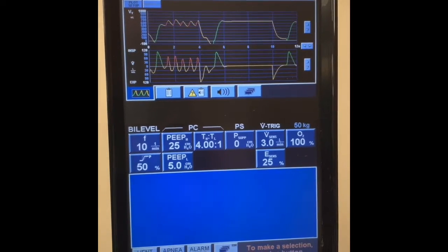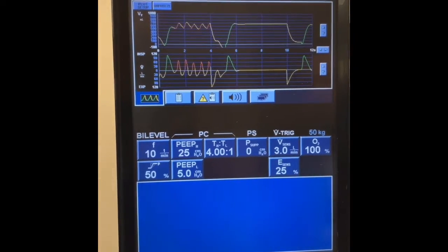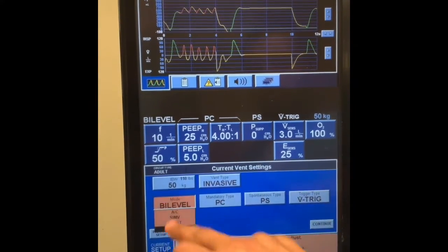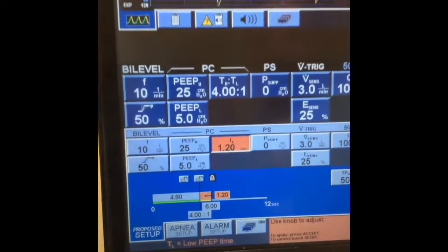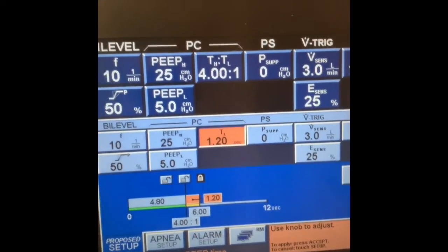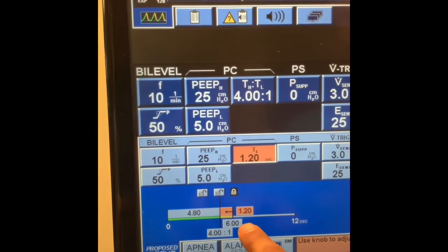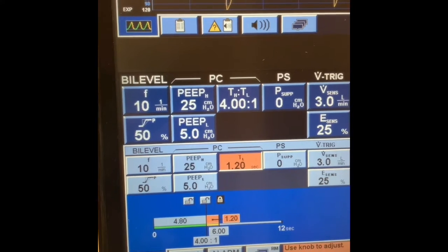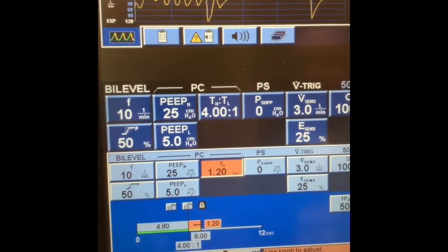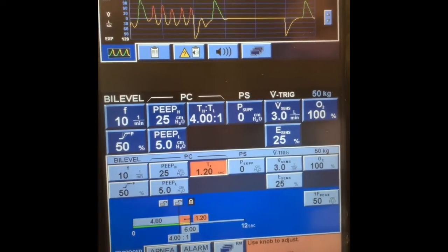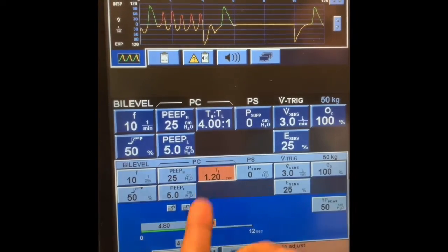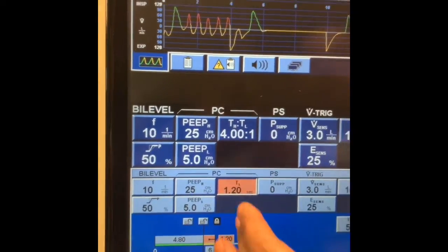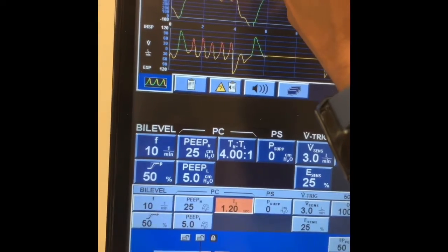If the physician wants you to set the time low, you can — just go continue and then input the time low. So the time low is 1.2 seconds. For a total cycle time of 6 seconds, your inspiratory time is 4.8. It doesn't really matter whether you choose to set time high, time low, or IE ratio. I like IE because I can have my set IE and then see what the patient is doing.